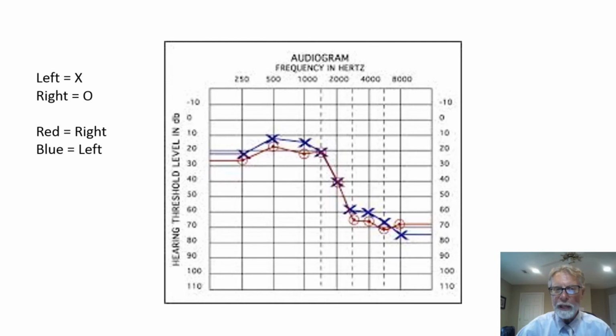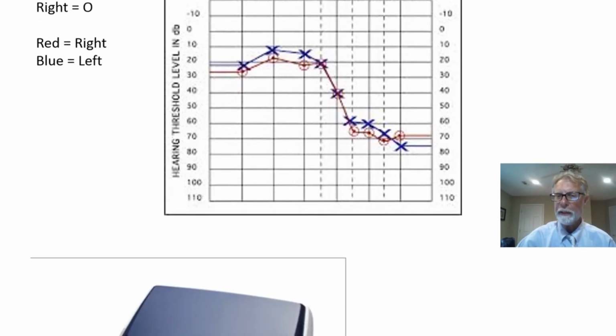So we would say that this patient has a high frequency hearing loss, because in the higher frequencies, these are down. Now, how much hearing loss is there? Okay, here's the last slide.